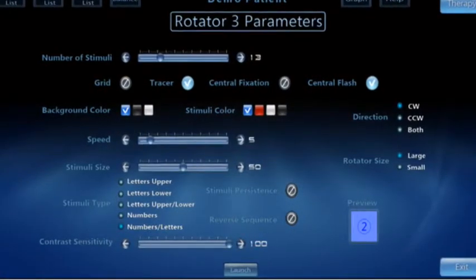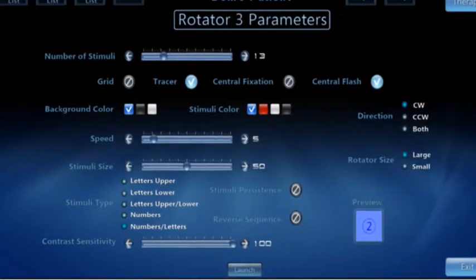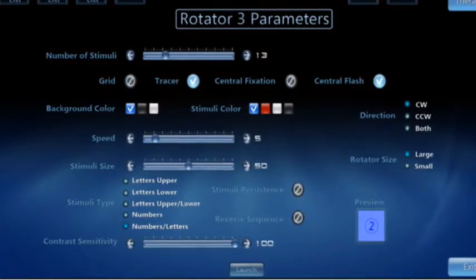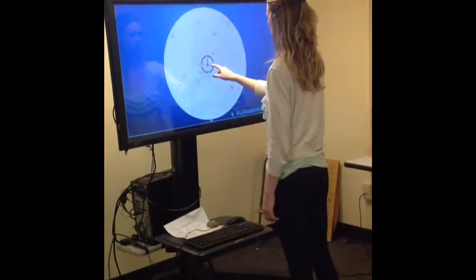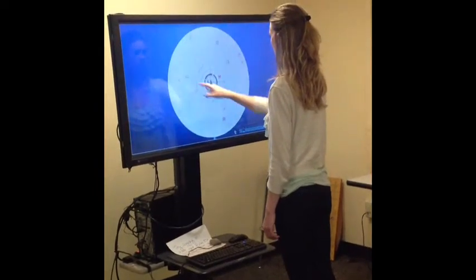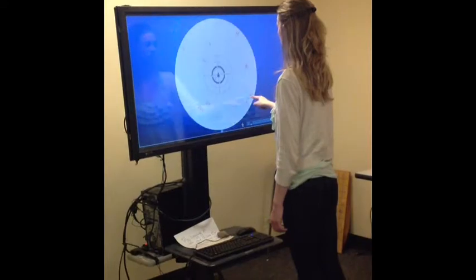Here are the parameters for Rotator 3. Rotator 3 includes letters and numbers. The patient has to touch the letters in alphabetical order or the numbers in numerical order.